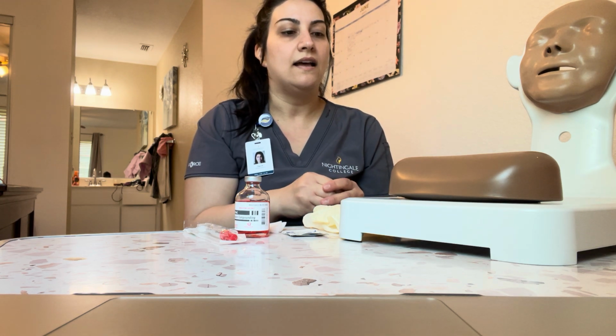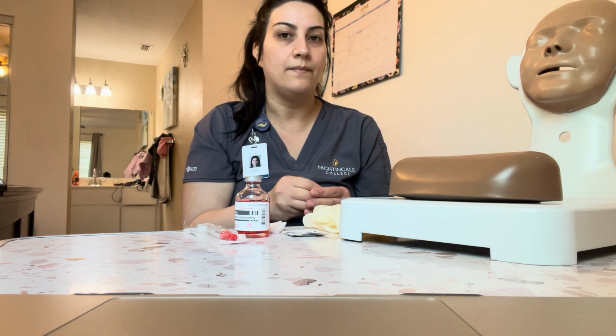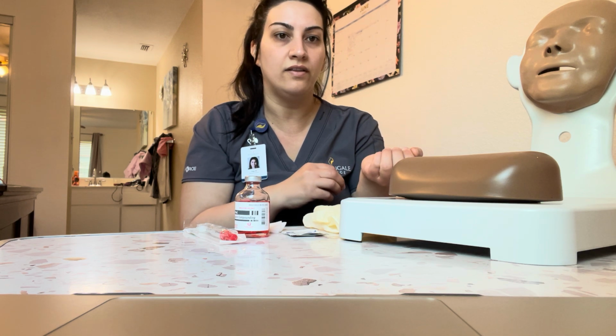All right, Ms. Smith. The reason why I'm here is that your doctor has prescribed a skin test for you. It is called a PPD. The medication that you're going to be receiving is called tuberculin purified protein derivative. The mechanism of that is that it checks the sensitivity of your lymphocytes.